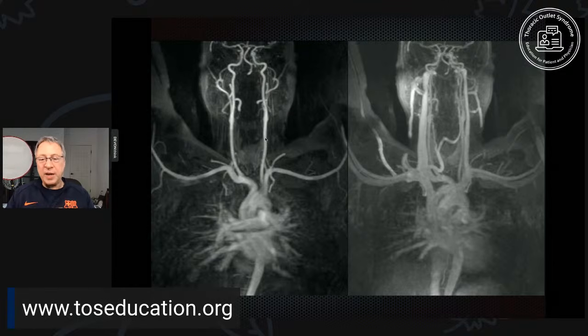When we look at the right side of the screen, you'll see a venogram, which was performed after this arteriogram. We just waited a little while and took more pictures. Now you can still see the arteries, but you also see the veins. So this is very useful as well.